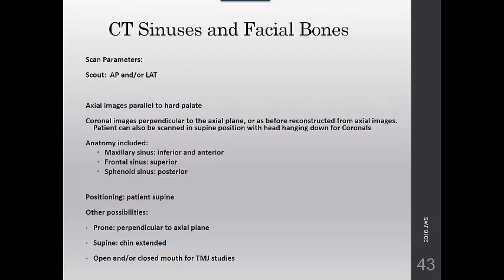And so as the patient changes planes, so does the fluid level. Could be obscuring some other disease on the floor of the antrum of the maxillary sinuses in the axial position.